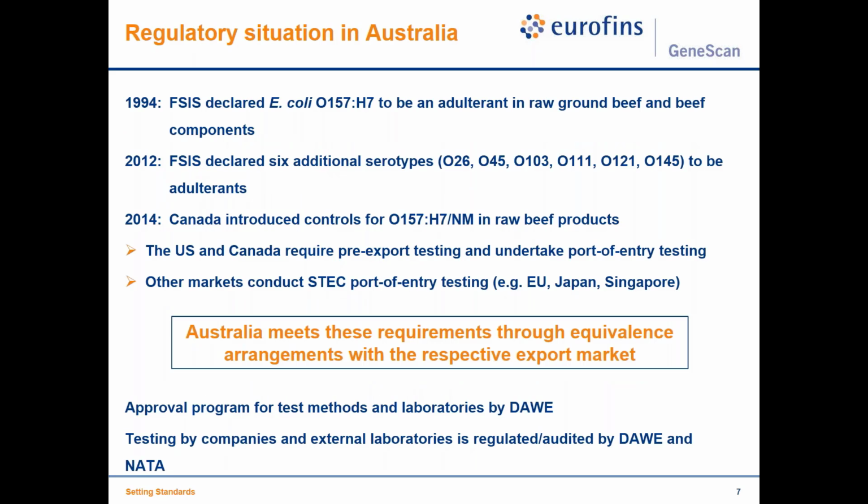Now, since we're talking about Australia, I wanted to start, when we look at the regulation, with a little bit of an overview on what is done in Australia at the moment. There is a very strong focus on export, of course, so it's very much dictated a little bit, I would say, by what other countries view in terms of STEC.